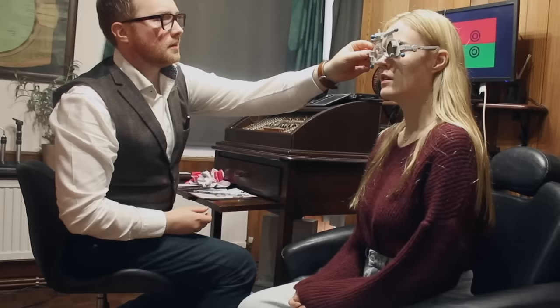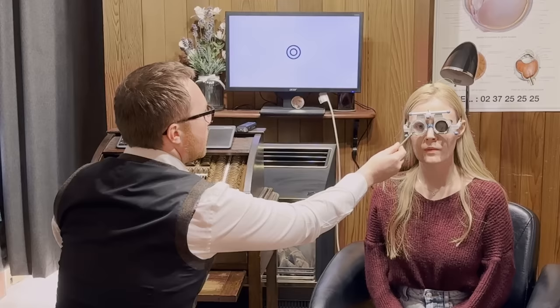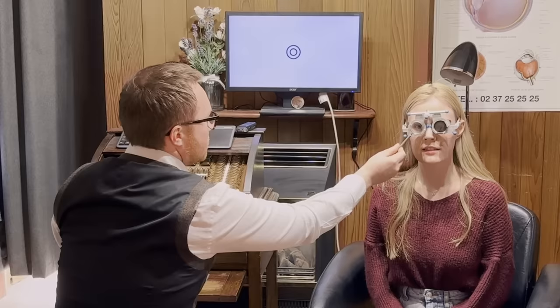And now the next thing I'm going to get you to do is to have a look at those two circles just there. I'm going to show you two blurry lenses. Now, neither of these lenses is going to make those circles crystal clear, so don't worry. All I'm going to do is see which of the two is the clearer. Okay, so as you're looking at those two circles, would you say they're rounder and clearer with number one, number two, or are they about the same? Two's better. Brilliant.